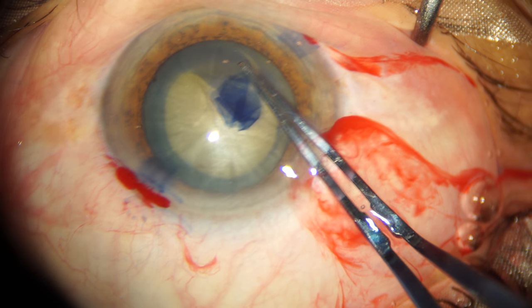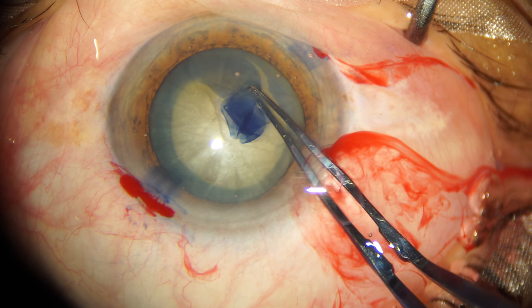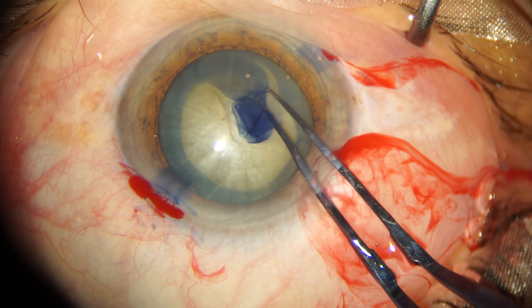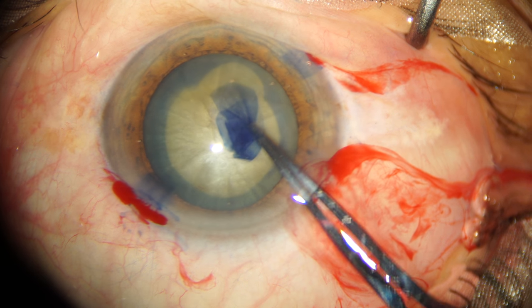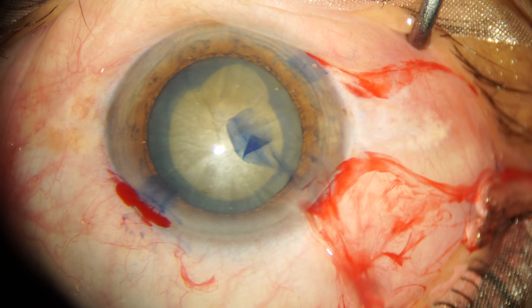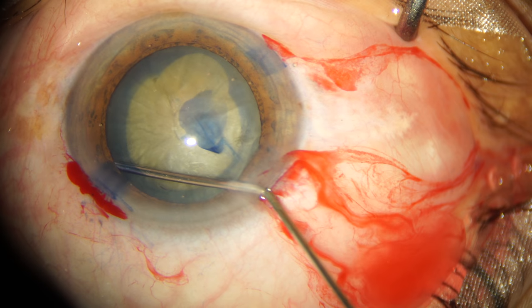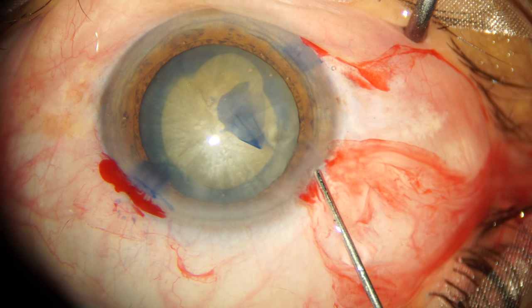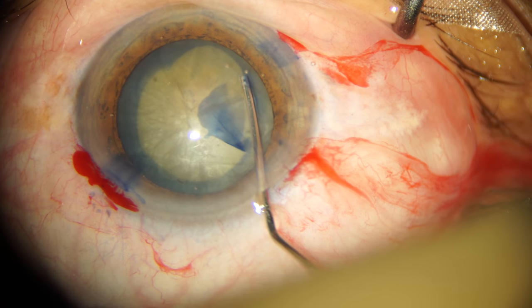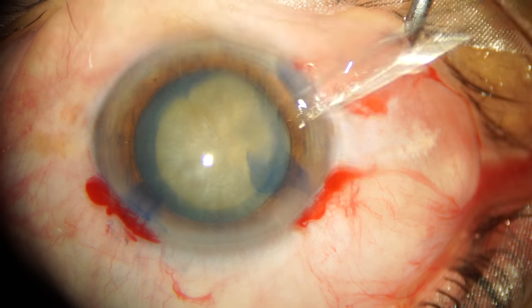I'm now grasping the capsular flap, and as soon as I get hold of it, the direction of force I apply will be towards the main incision — like this. As you can see, the flap turned around and came back and joined the edge of the remaining capsule. Now that I've ensured a continuous capsular rhexis, I move ahead with hydrodissection and try to free the cortico-capsular adhesions.